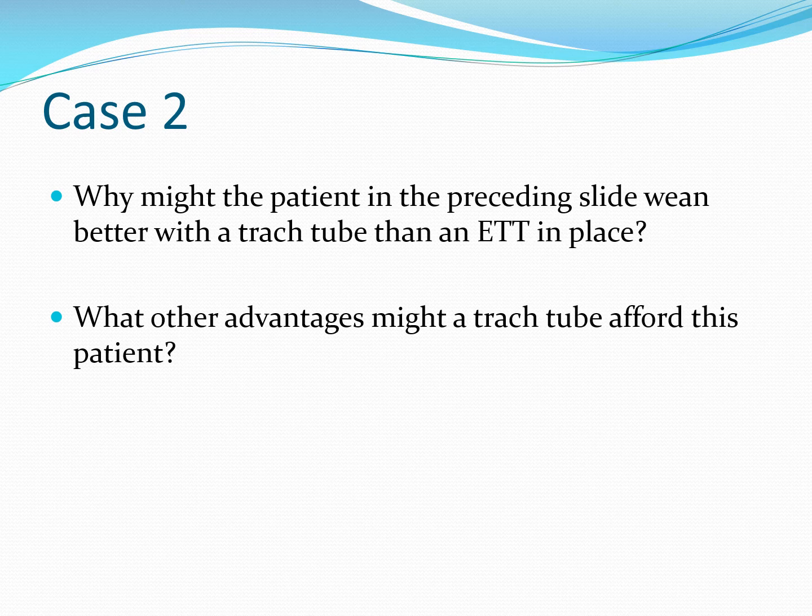And then what other advantages might the trach tube afford this patient? Things like eating, and some very important things like potentially, as they get weaned off or are on the verge of that, speech being facilitated, particularly if we got to the point where they're only on the ventilator at night, perhaps during the day they can get a speaking valve in place. So there's really a whole lot of advantages. Mouth care can be much better facilitated with a trach tube versus an endotracheal tube. Many advantages to a trach versus an endotracheal tube.